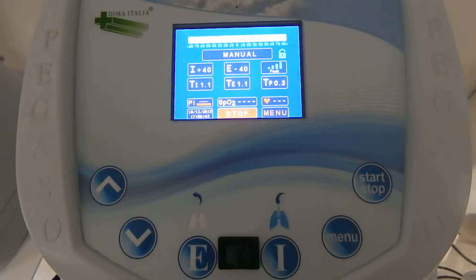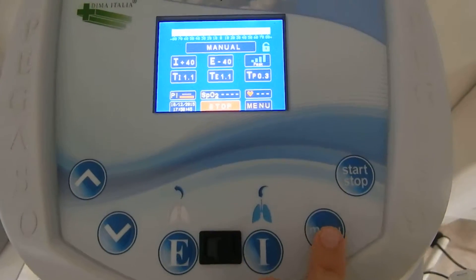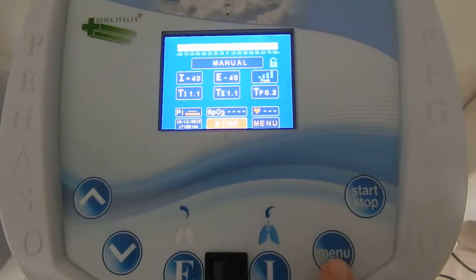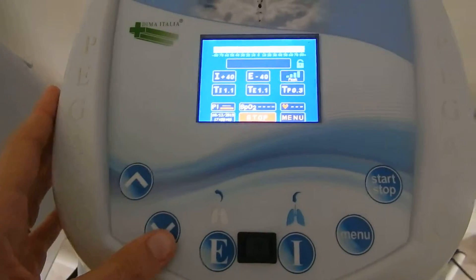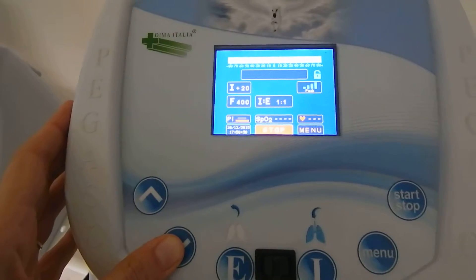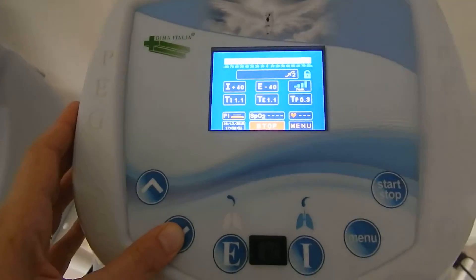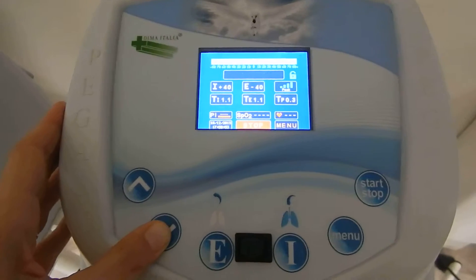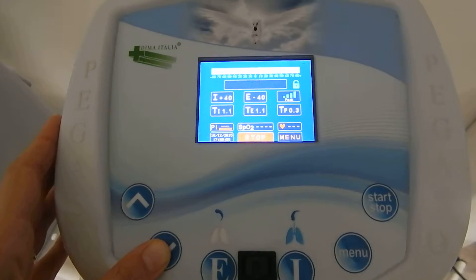If we want to change the mode, we simply press Menu on the keyboard and then scroll down with the arrows until we find the desired mode. We will switch to Automatic.